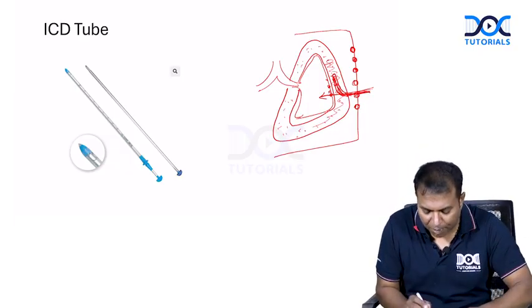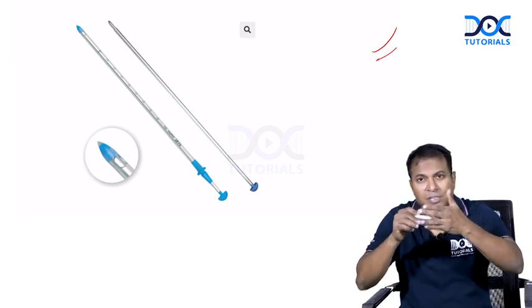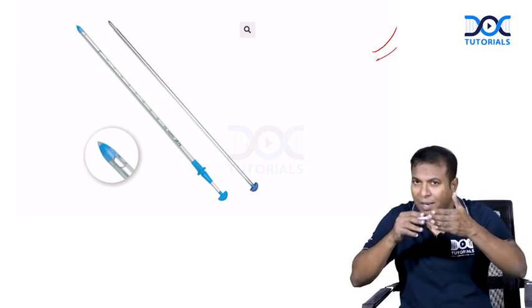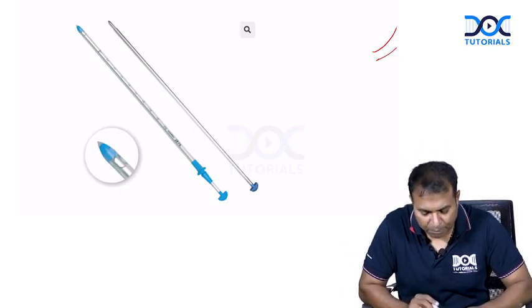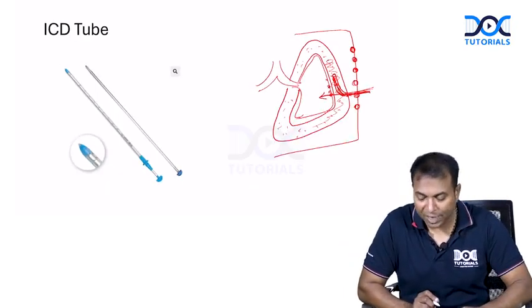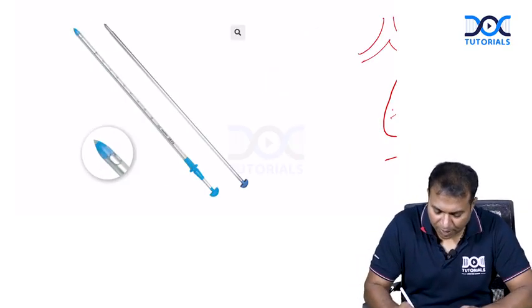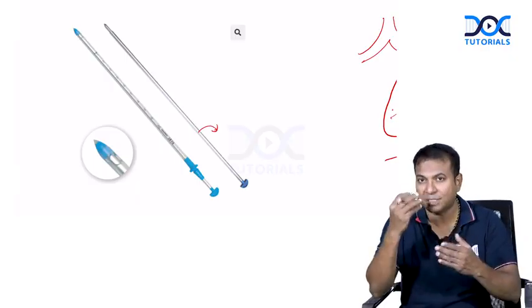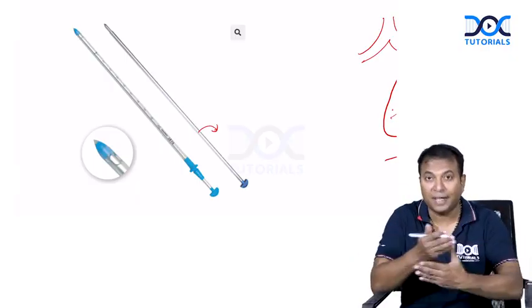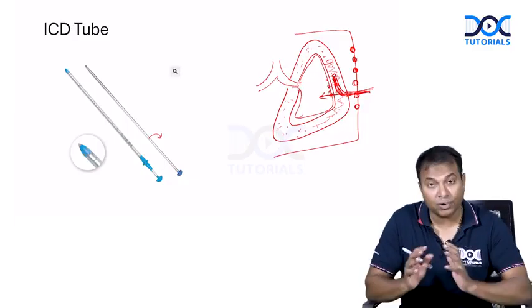We have a blunt tip, because we are going to go through the muscles. Going through the muscles after opening the skin incision is going to be a simple phenomenon. We have to go through the muscles with a blunt tip. That is a typical intercostal drainage tube. Nowadays, the intercostal drainage tube is coming in this way. This is an inner one, which will be removed once the tube is inside. This is the inner one which has a blunt tip to enter the thoracic cavity, the pleural space. Please don't forget this basic thing.